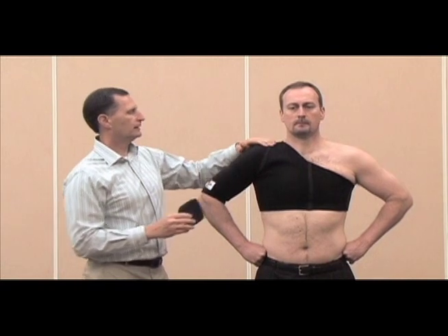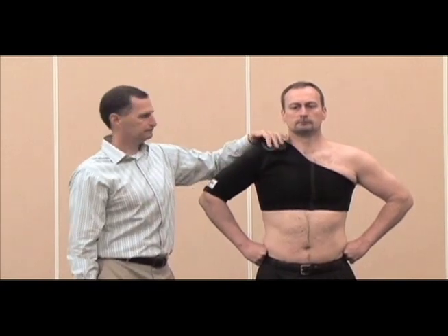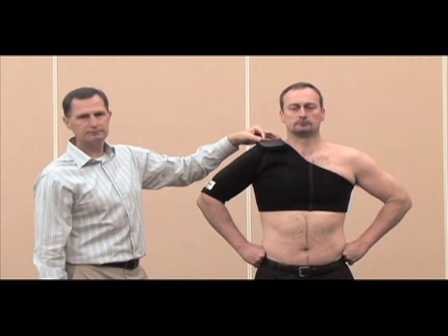The Soli also comes with an accessory — a hard shell donut for AC separations. It just needs four Velcro tabs adhered to the donut. Identify the AC joint, stick it to the Velcro sensor material, and once that is in place, it offers some protection for AC separations.